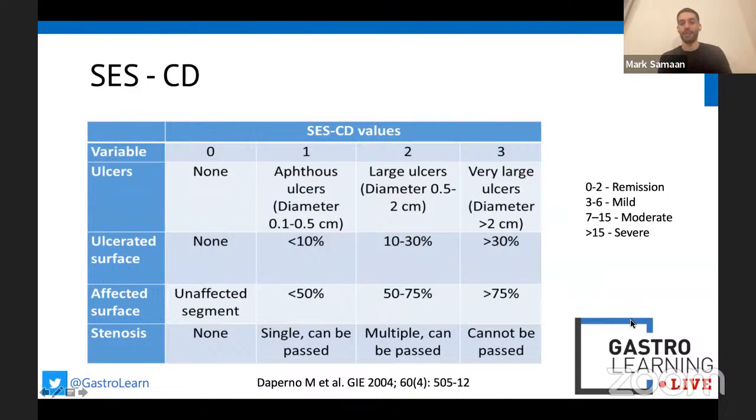Just put some structure around it, maybe put a number alongside it, and then we're all talking a language that hopefully is common, means something in terms of outcomes, and guides treatment. I think that's great advice. And I think the point you make is that if the expert IBD endoscopist is keeping these things on a wall chart, then the rest of us should. Right. And then we end up having a record that provides much more transferable information for other teams. Can we move on to dysplasia?